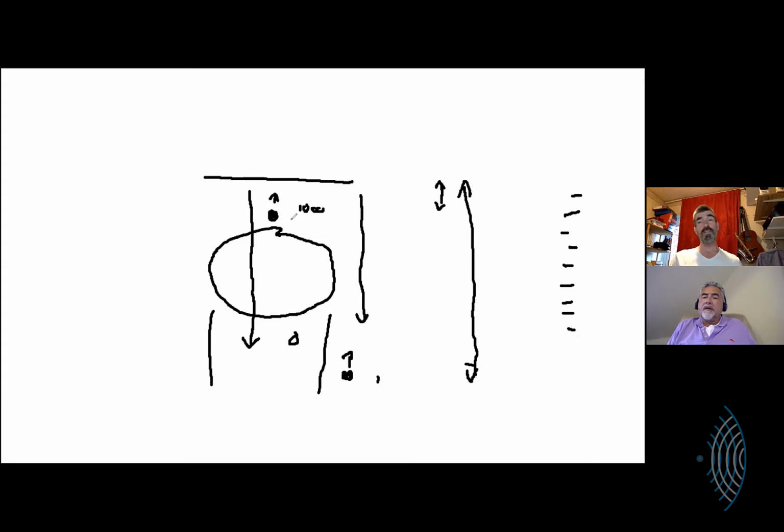Or more often in musculoskeletal, we're looking at structures that have maybe been injured. So you're looking through an area where there's been bruising and bleeding in, and that's very fibrosed. So that would then be lots and lots of fibrous layers here, and this area would actually be darker.